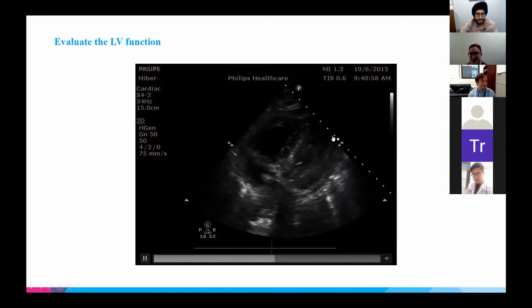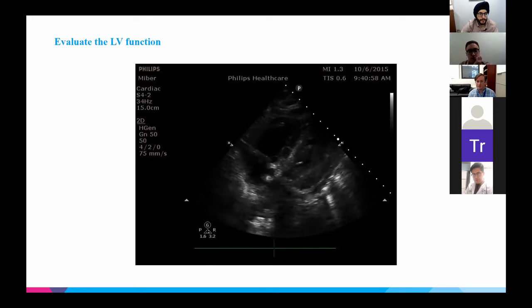And so I just wanted to hear your thoughts on the left ventricle. We just have 29 responses for this one. And let's give it 10 more seconds. All right. Okay.